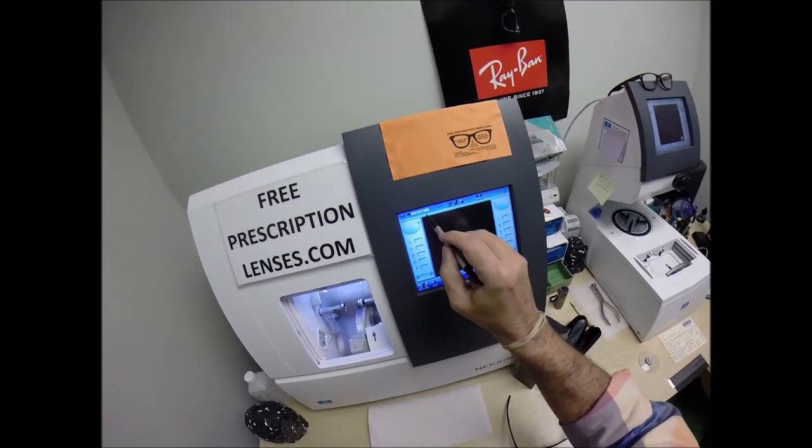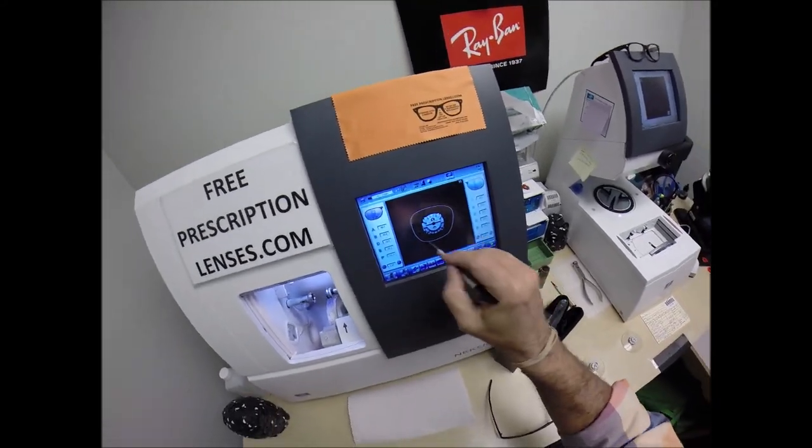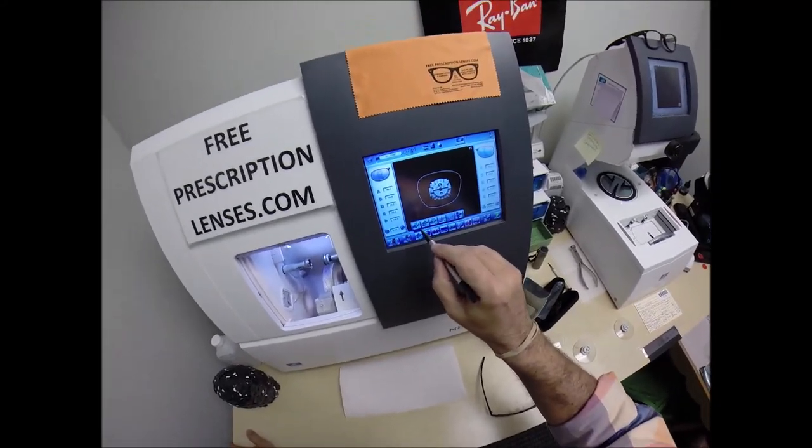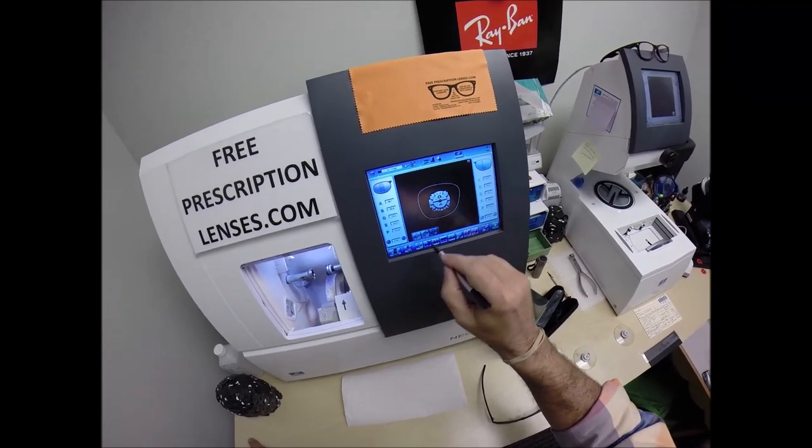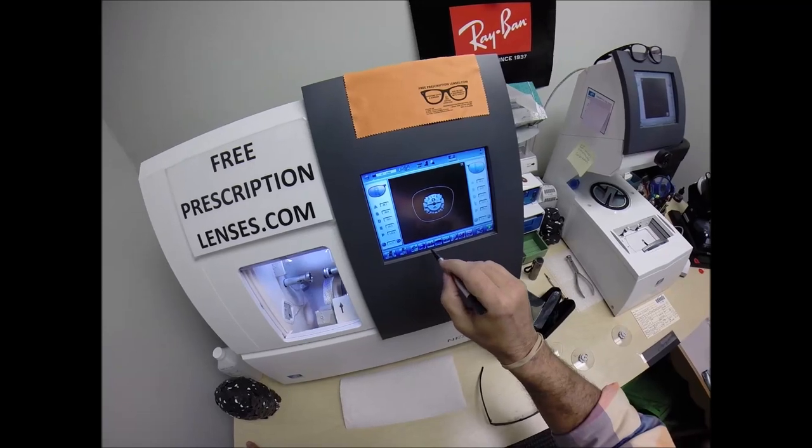Let's go ahead and wake up the computer. 1166, that's the shape that I'll be cutting. These are polycarbonate lenses. If they were plastic, high-index plastic, or Trivex, I would select that. But we're going to stick with polycarbonate.